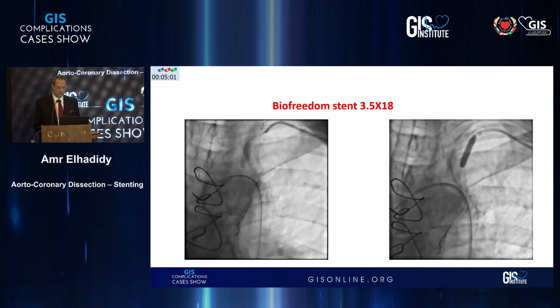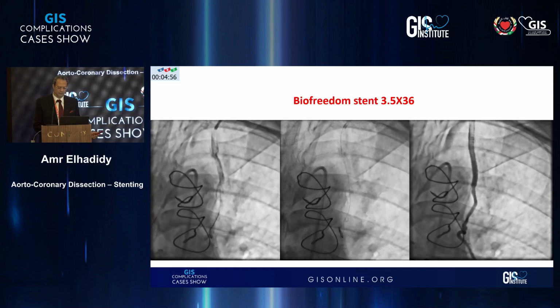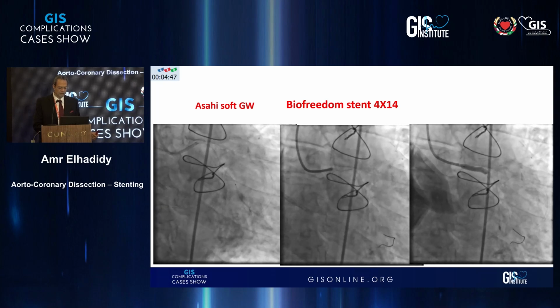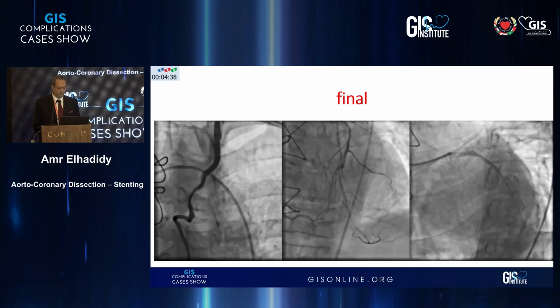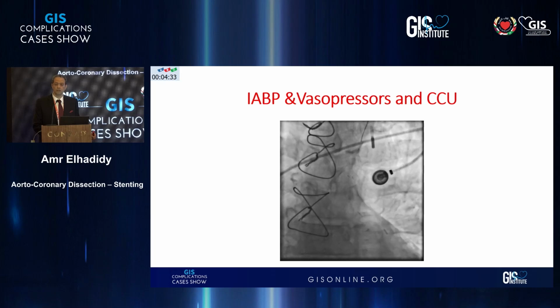And now we balloon, and then we stent it. And we look here, and then another stent, 3.5 by 36, which has a good flow now, and the patient was stable. And we stent the left main to the OM. There's definitely a slow flow in the distal OM, but the LIMA is okay, the feeding vessels are okay, and we have some flow in the CX, and this patient was put on intra-aortic balloon pump at that time during the procedure, and was referred back home, and on coming back, we did the RCA for him, but I don't want to show the result. It is a very good result for the RCA also.